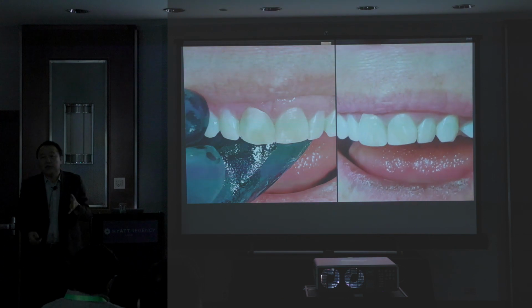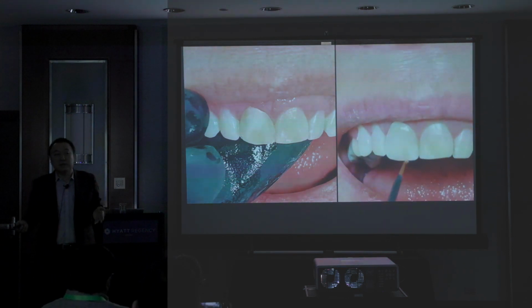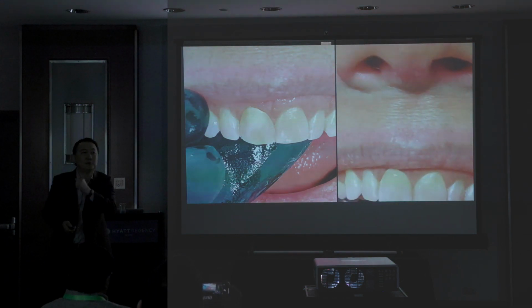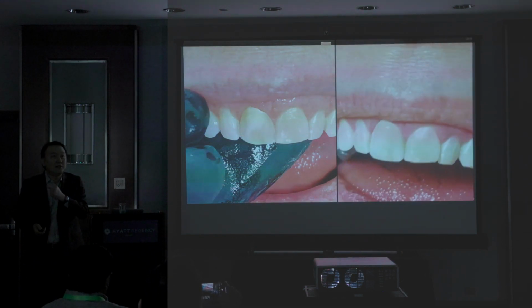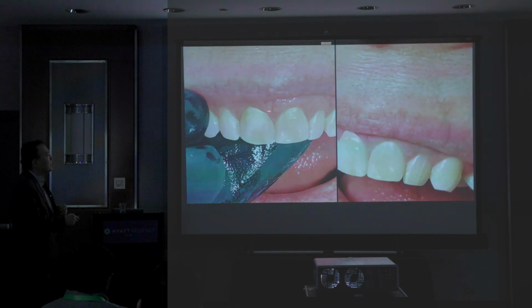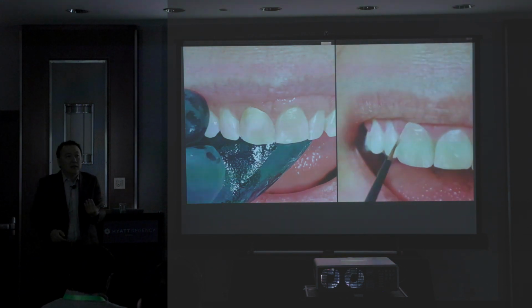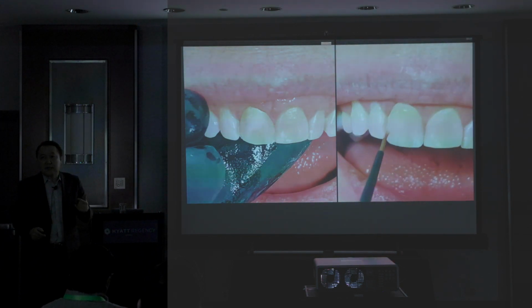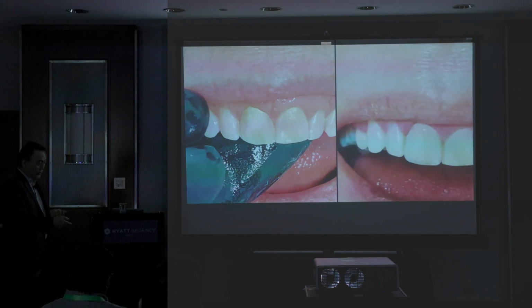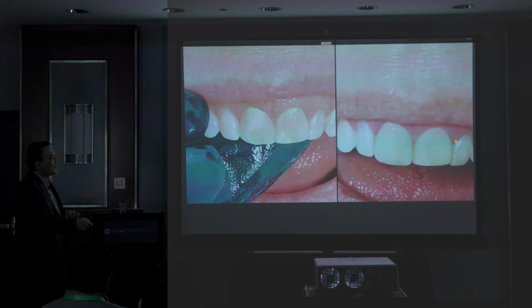So usually dentists do not give me the room, right? How much room do you have? 5/10, 6/10? You're lucky, maybe 1.5 millimeter facial room I'm talking about, right? Sometimes you have only 2/10 millimeter. But you have to know the internal color, then we can put it in there. And not only this, I like the white color underneath, opaque. I will show you after this. So anyway, this is my concept.